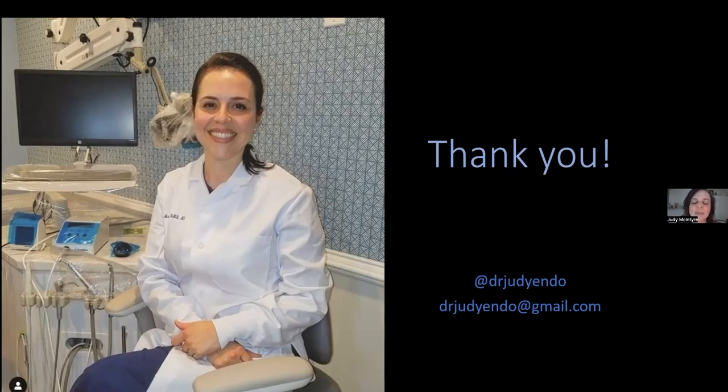True. Do you cold test teeth before placing crowns or changing medium or large restorations? So I don't place crowns, but I would highly encourage all restorative dentists to cold test teeth before they replace any medium to large restoration, and especially all crowns. Yes, very great question. Cold test always, and take that PA.